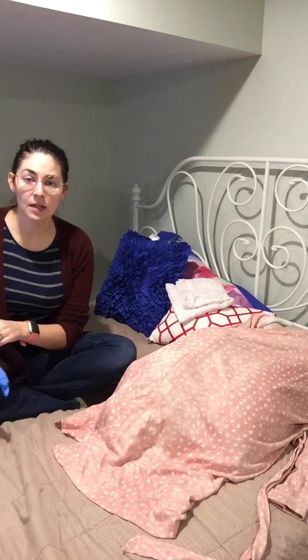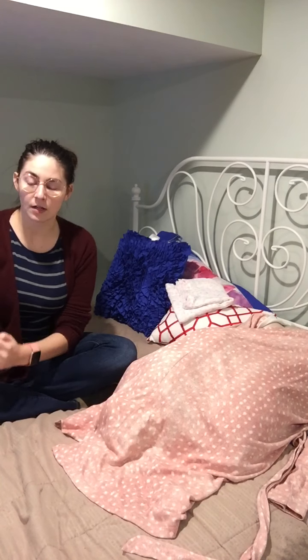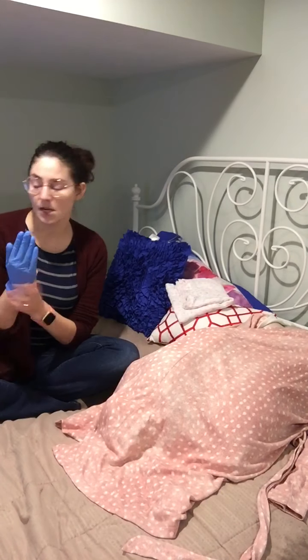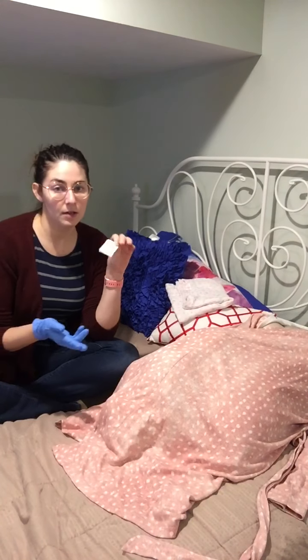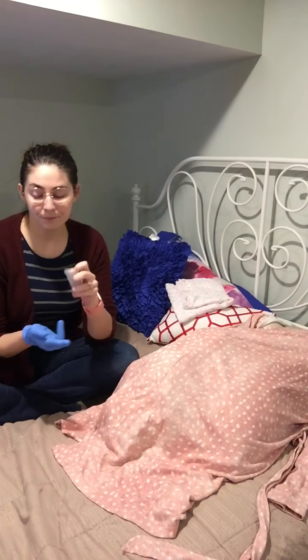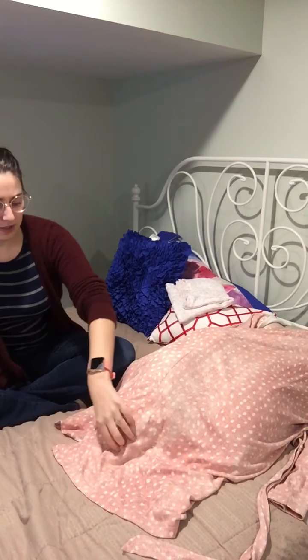I would have washed my hands and be wearing sterile gloves — we're pretending here since I don't have any. An assistant would help me apply sterile lube to begin the exam.